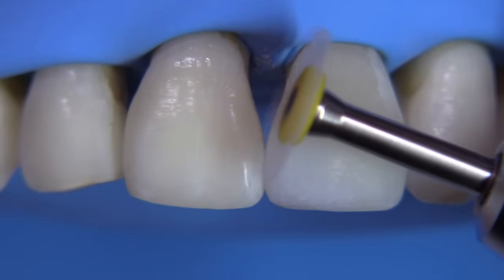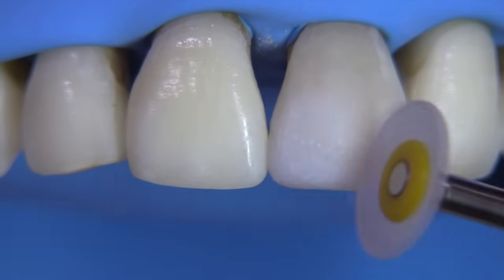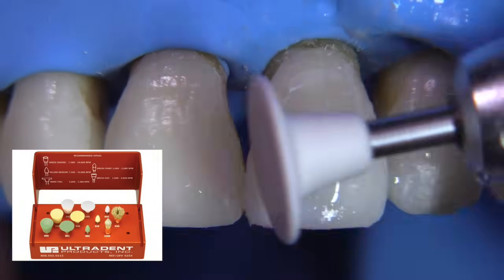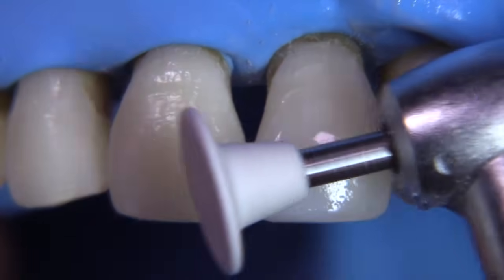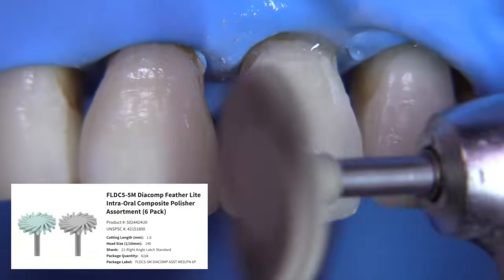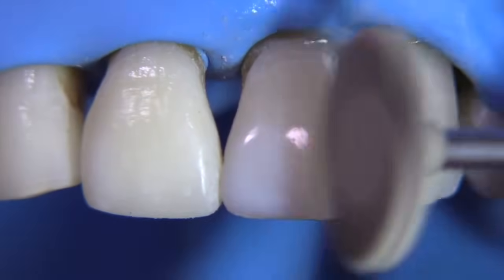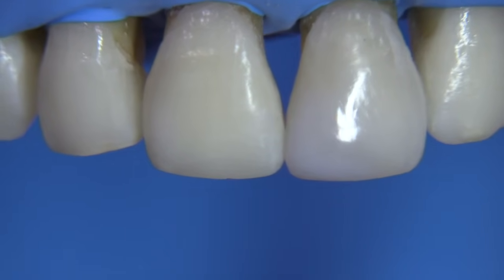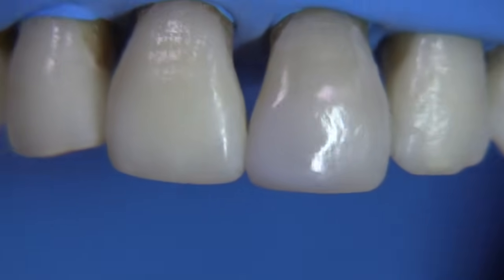These discs come in two different diameters, so use the smaller diameter disc to get into hard-to-reach areas. I then follow up with the Ultradent Jiffy system — a nice all-around polishing system we can use on the lingual as well, it's a three-step process. Then I follow that up with the Brasseler Diacom Feather Light, a two-step process — showing the final step here. These are great because they get into all the little details of the surface and give you a nice finish. But the problem is this composite is just too flat — we can polish the heck out of things but it doesn't have the texture that teeth have.